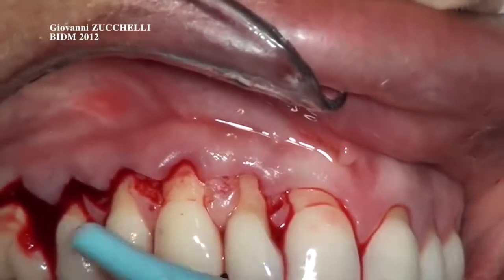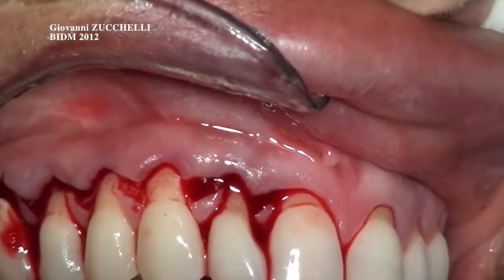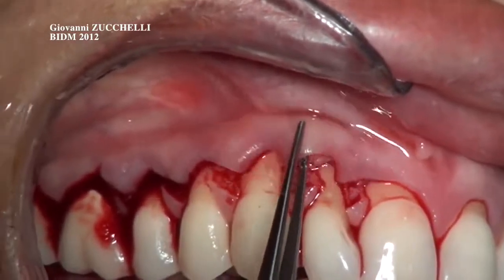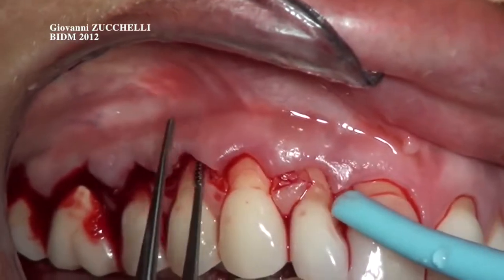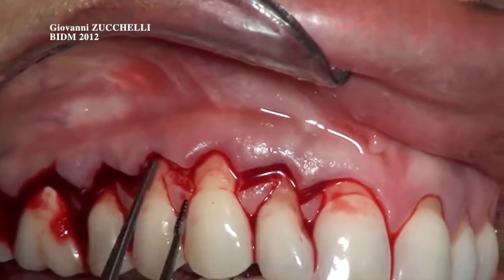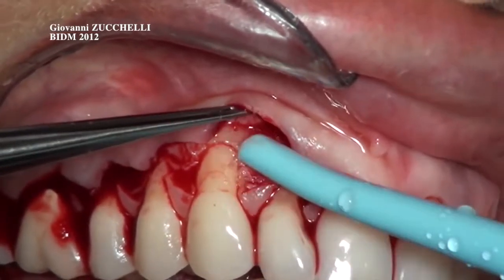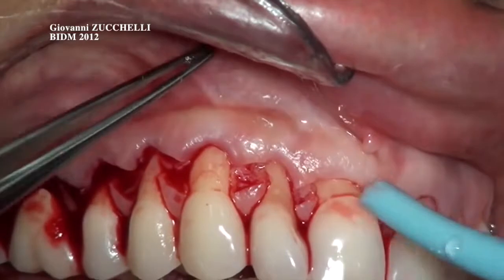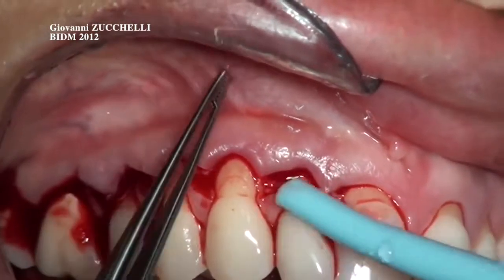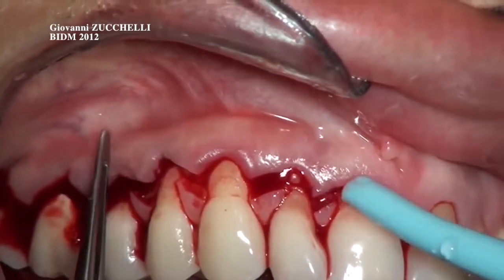Now the problem is in fact how to coronally advance the flap, because obviously the flap is absolutely immobile, and the reason why the flap cannot be advanced at this time is because there is a lot of insertion inside it. And it's the muscles of the lip, which are almost perpendicular to the keratinized tissue, which is going to cover the root.